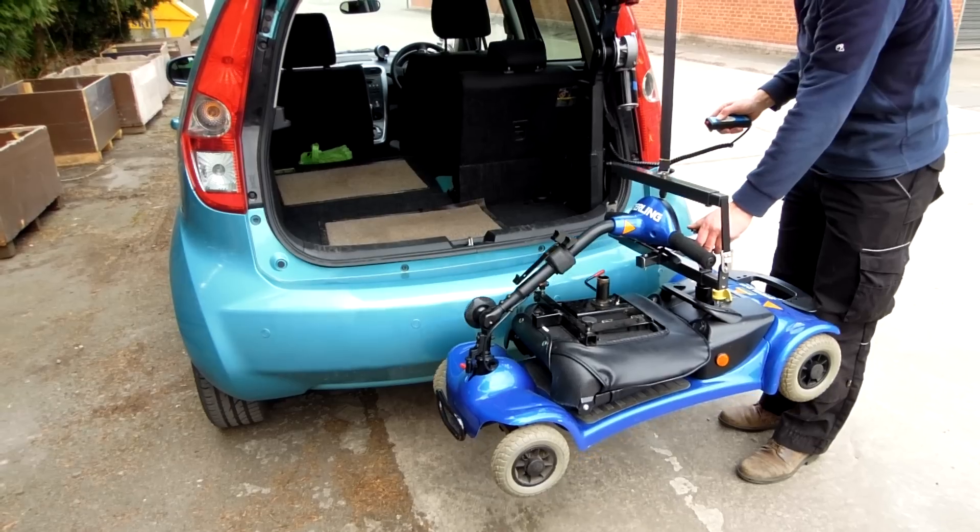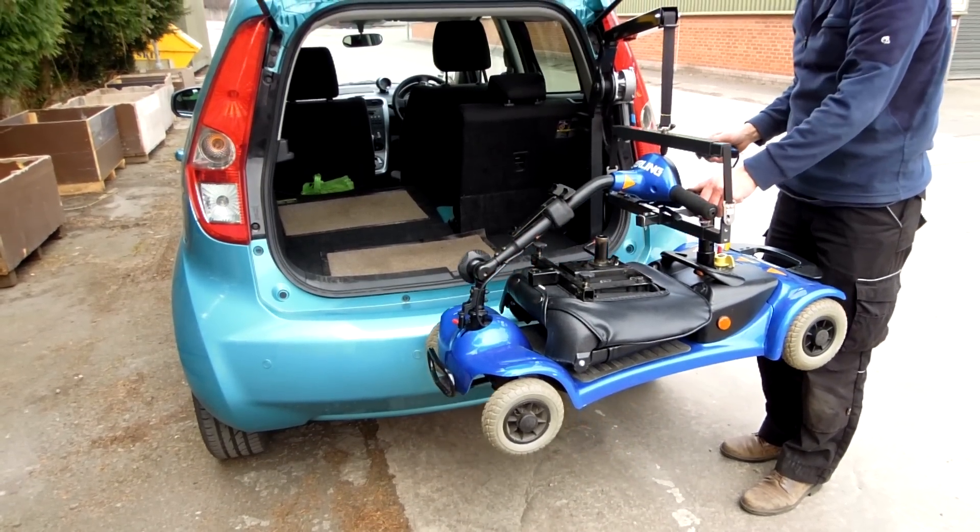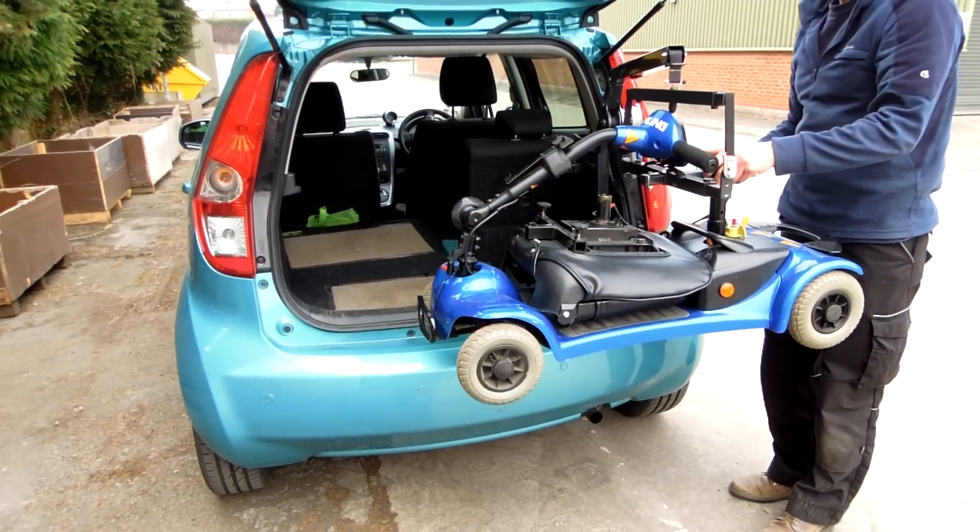Put that up there, keep it a bit steady — it's quite close to the bumper on this car since it's such a small car. Put that up to the top.